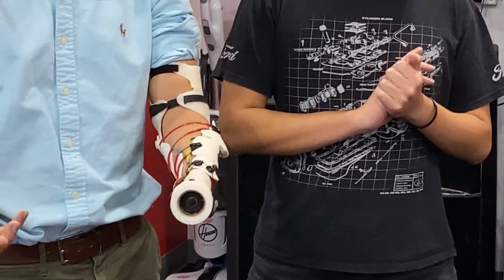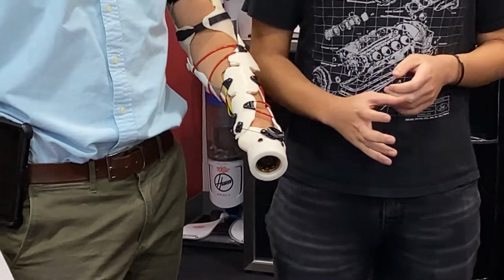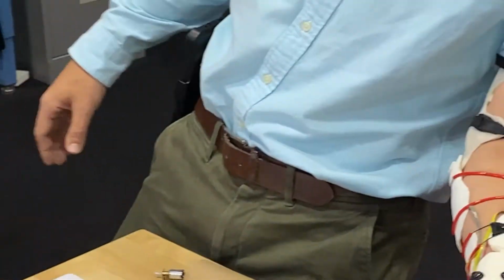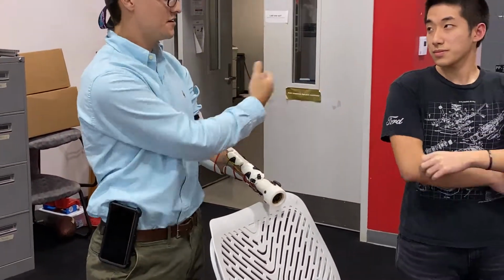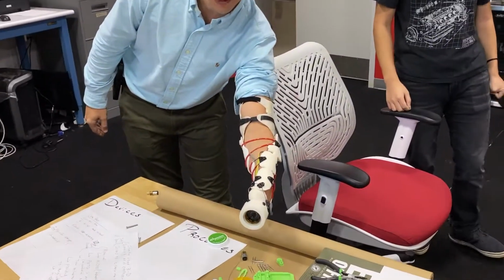With the Raptor hands that we used to have, when Chad needs to grab anything on the table that's lower than his natural body height, you have to tweak your body a little and line up just right and grab, and then do a forceful contraction and hold it. Whereas now, I'm able to come in and guide a little bit better.